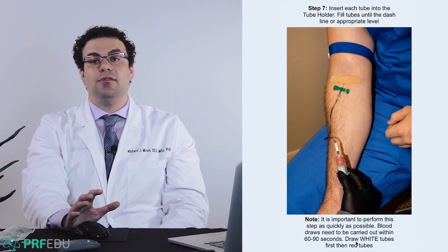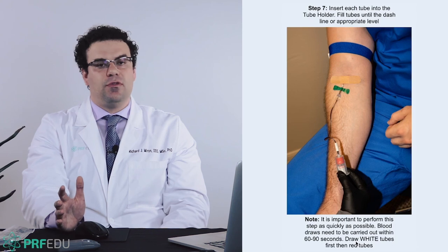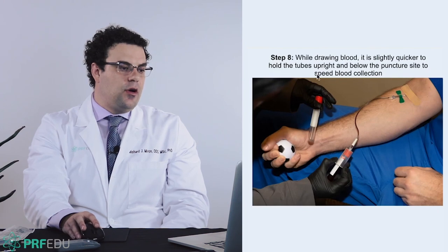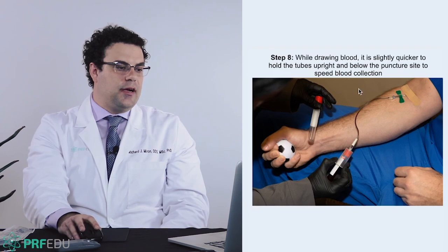So I highly recommend, even if you're an experienced clinician or you have an experienced staff doing this, just for fun, time them one day. Make sure that they're doing it in the right amount of time. Okay. While you're drawing the blood, you can always ask your patient to squeeze the ball. Okay. It'll go a little bit faster.